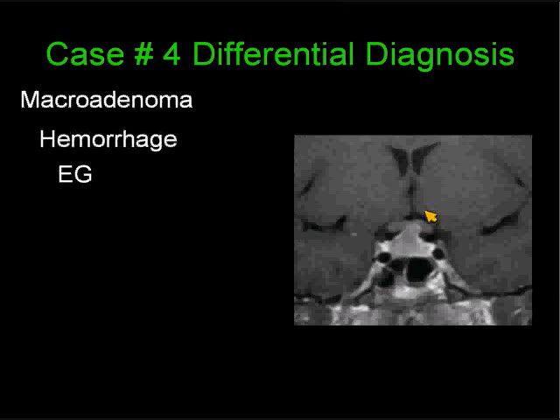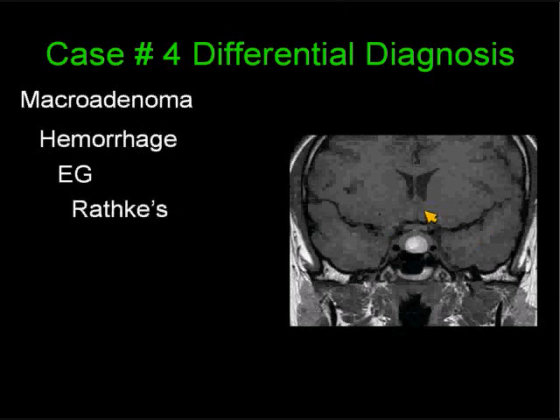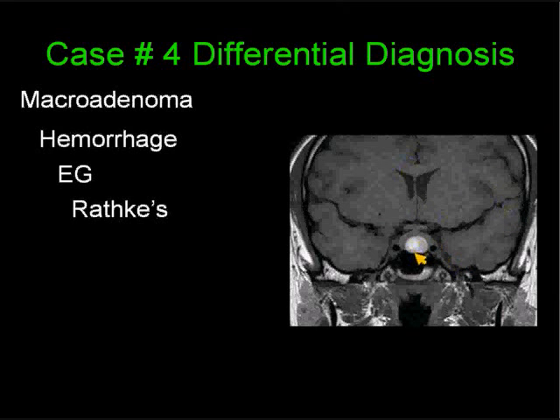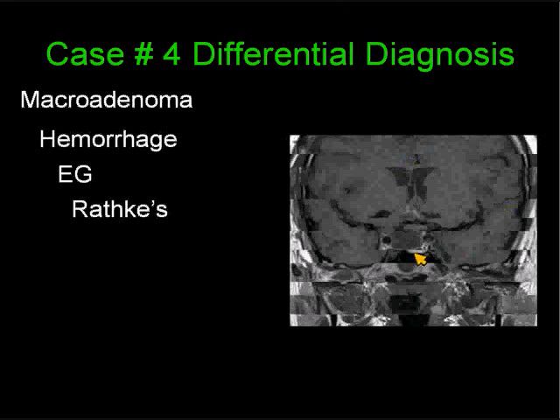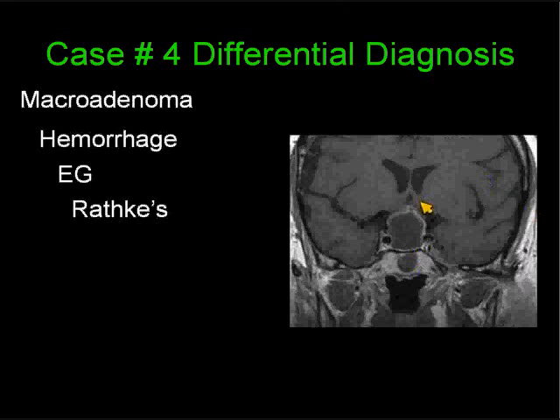Eosinophilic granuloma may involve the pituitary gland and stalk — these are children, and it is a difficult diagnosis to make unless you get a biopsy. Rathke's cleft cysts are seen quite often; they can have variable signal intensity and appearance. Only 1% of all craniopharyngiomas are intrasellar, while a Rathke's cleft cyst is much more common.